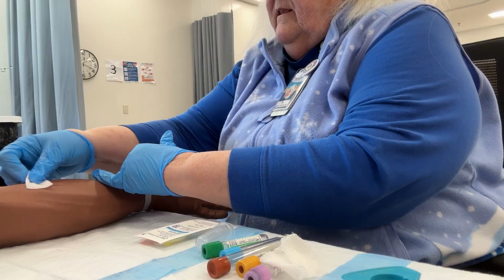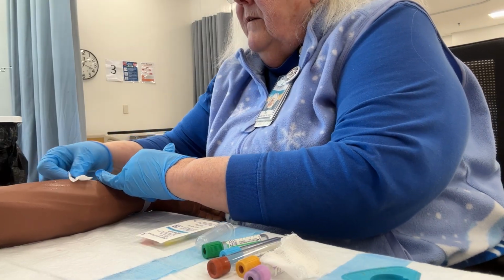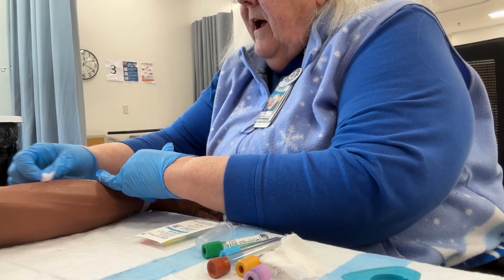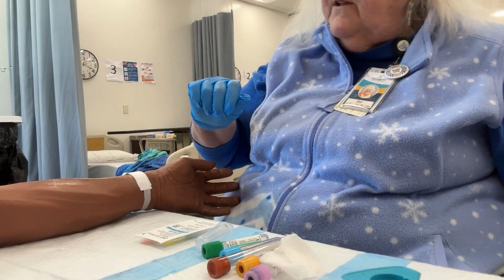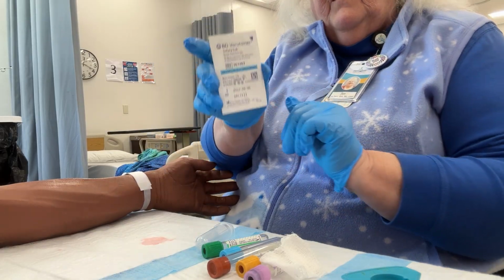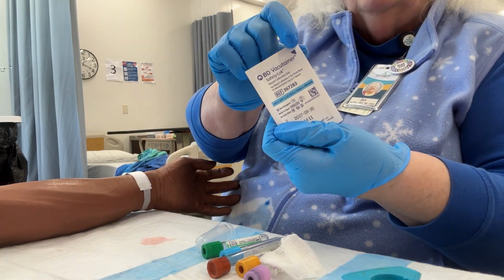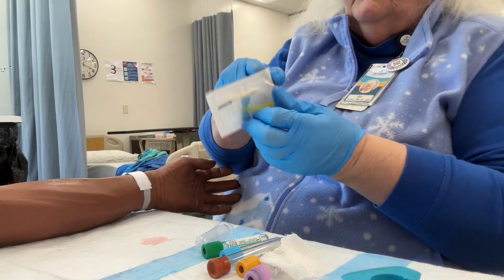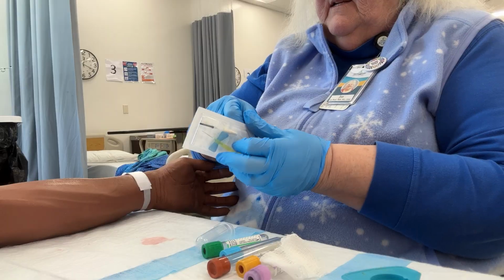So now I'm going to clean, 3, 4, 5, 6, 7, 8, 9, and 10. I like to clean for a good 10 count. You'll see people that just go, well, that's not really clean. Then you pick up your Vacutainer needle, and you'll see that there's an arrow, and it's always at the opposite end of the needles. All needle items open at the opposite end of the needle.